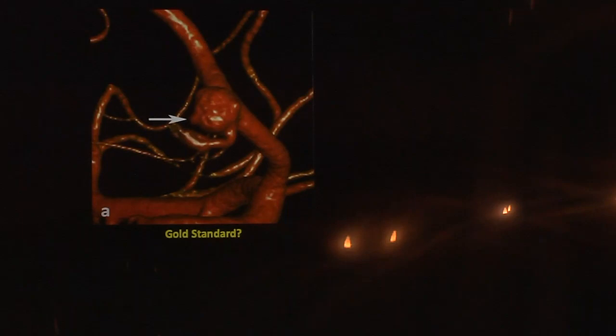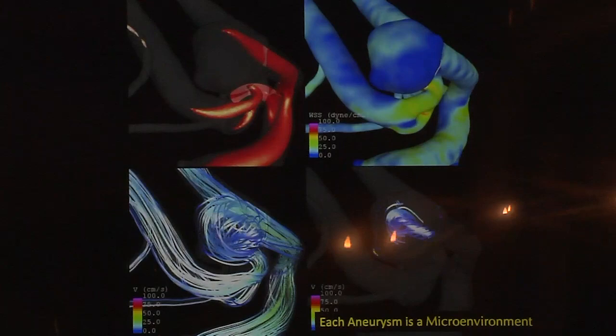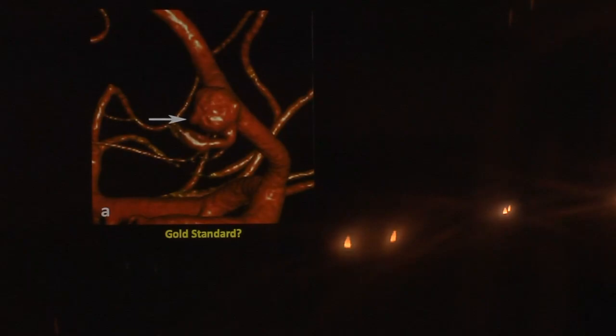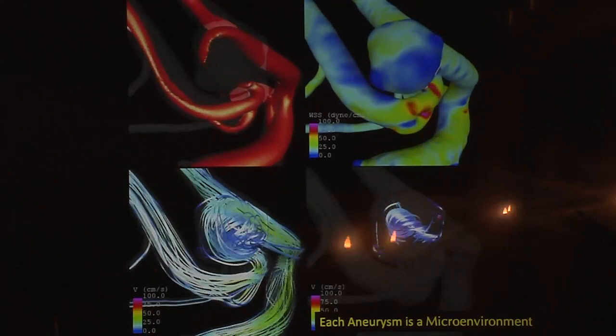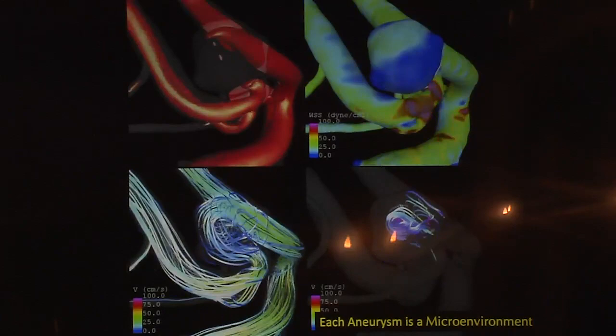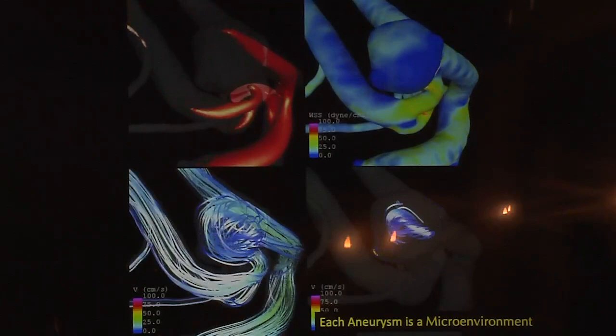This is probably not the gold standard because it gives us only part of the picture. We also have to account for fluid dynamics, wall shear stress, and vortex ratio. In areas of increased enhancement where the bleb is, we see decreased wall shear stress. The flow jet goes to the upper part of the aneurysm — that's probably where the aneurysm grows — but the areas of decreased wall shear stress with more inflammation and more enhancement are where the aneurysm is likely to rupture.